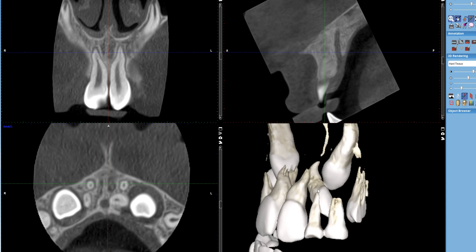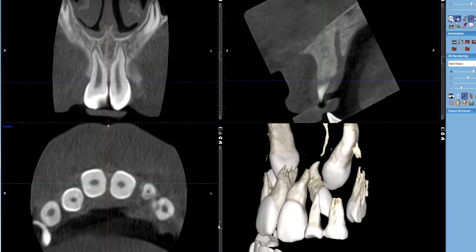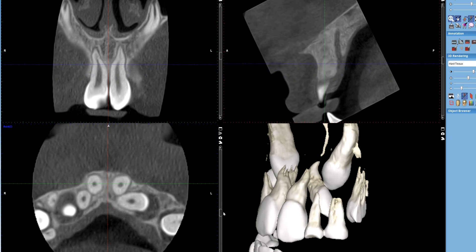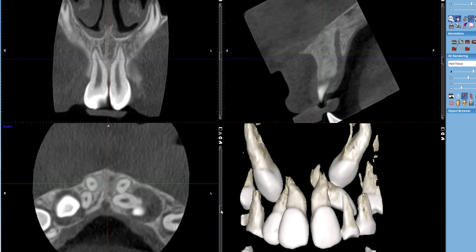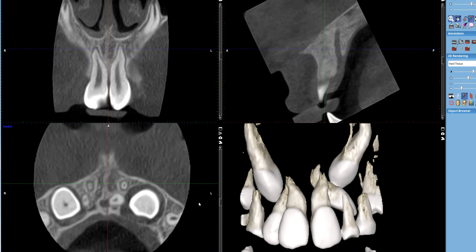What we have here is the lateral incisor that's been displaced or positioned lingual or palatal to tooth number 9, which can be seen in the axial view. Let's identify these structures in the axial view: two central incisors, primary lateral, permanent lateral, and as I move toward the apex. These are the two permanent lateral incisors. This tooth is positioned here, and that lateral — relatively horizontally positioned — can be seen here, along with the follicle of the lateral and then the canine.